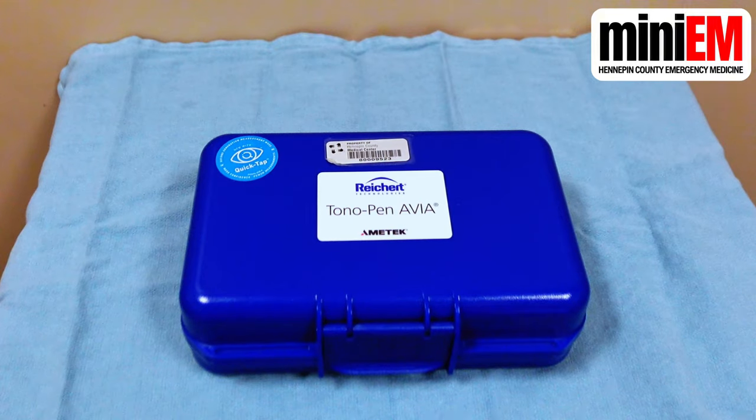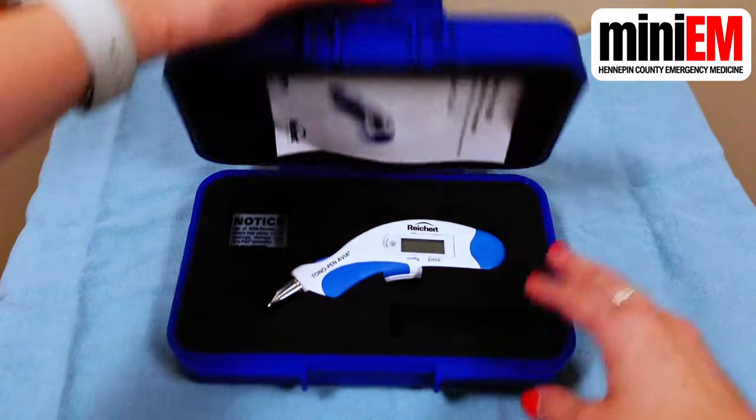Hello, welcome to Mini-EM. This is how you measure intraocular pressure using a tono pen in the emergency department.